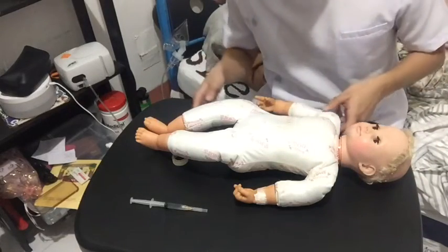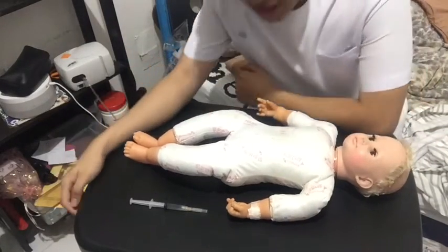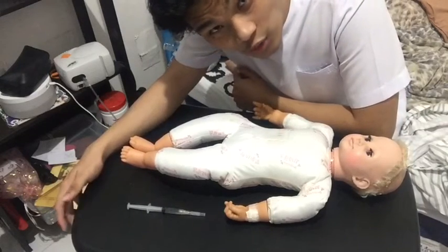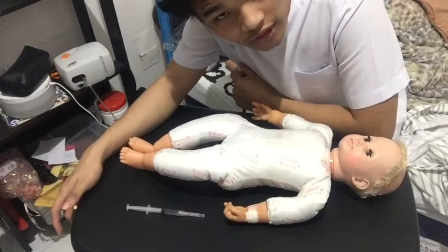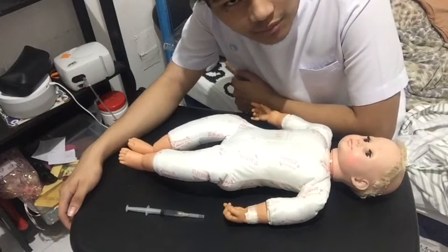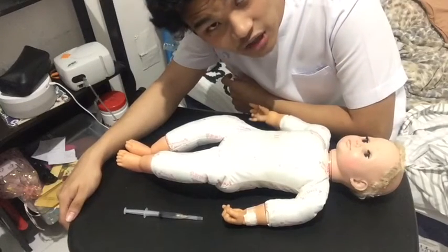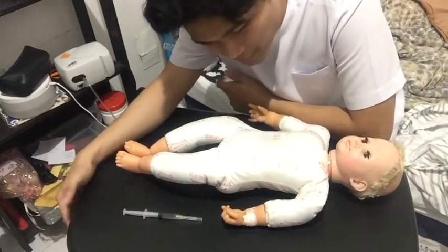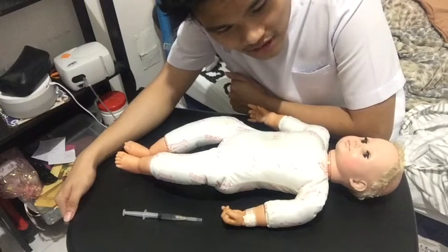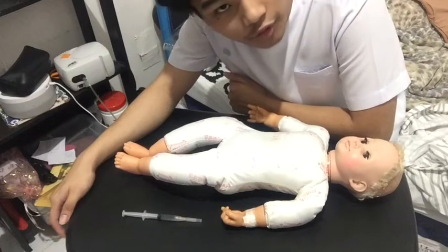Now after having proper hand hygiene, we're going to be explaining to the mother what we're going to be doing, the nebulization. At the same time, we're going to be explaining to her the possible side effects that the child may encounter. The purpose of this is to avoid any anxiety. At the same time, this gives the mother more knowledge on what we are doing.